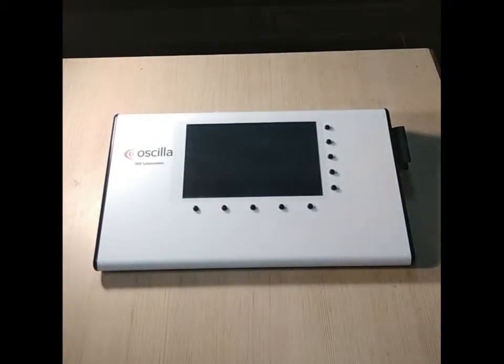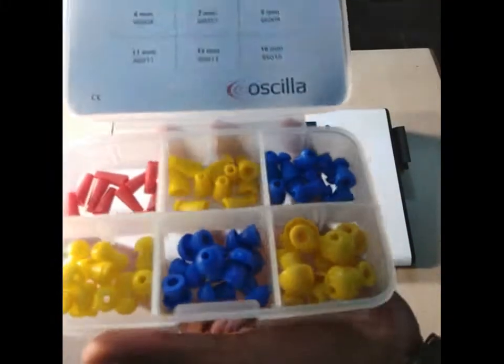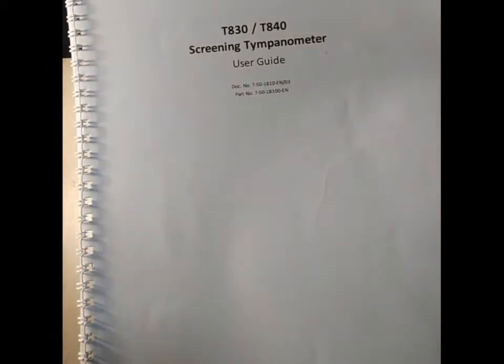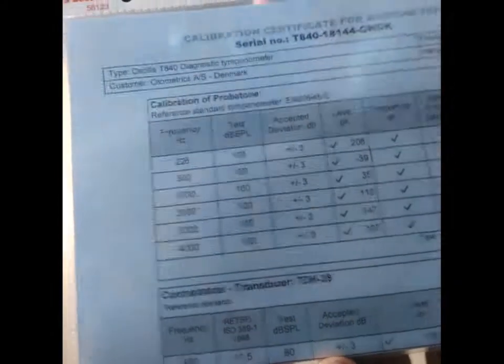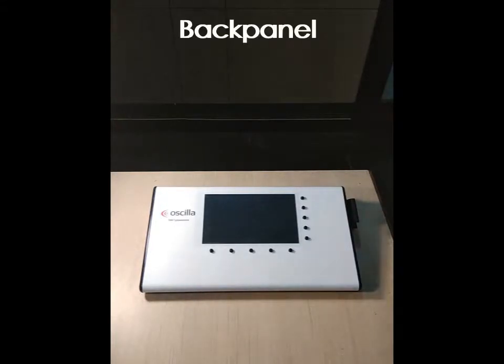There are different size tips included. This is the tip box you get — it has different size tips and the size is mentioned on the box. There is also a user manual included so you can use the tympanometer properly, and a calibration certificate is also provided. That's all about the components and accessories of the tympanometer. Now let's talk about the back panel.